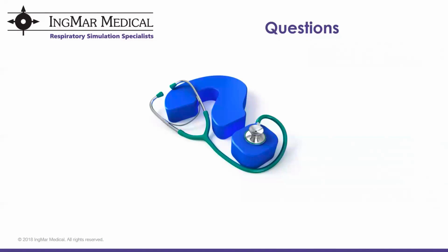So the next question we have here is, for the different disease entities you showed, how many scenarios are there? So I'm assuming that for that question, you were referring to that list of conditions that I had provided earlier in the presentation.